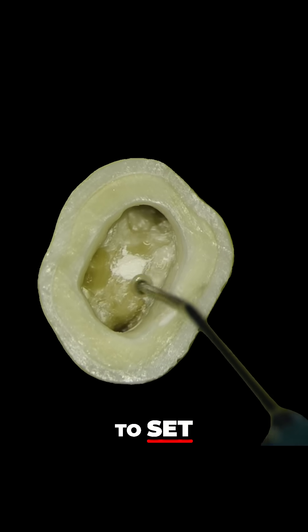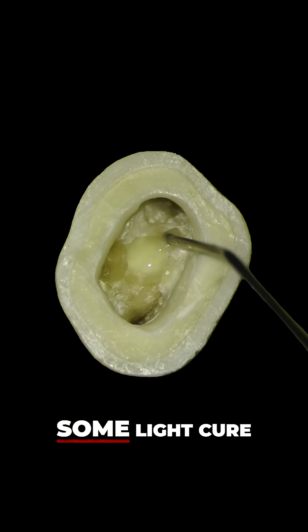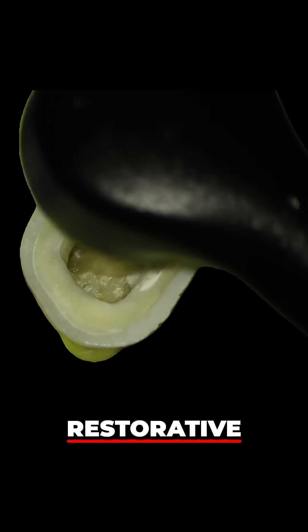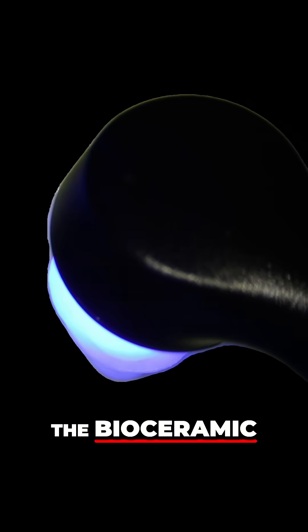Because it takes a while to set, what we're going to do now is place a bit of GI — some light cure GI — over the hole here, so we can carry on with our restorative protocol. This is not going to affect the bioceramic putty at all.